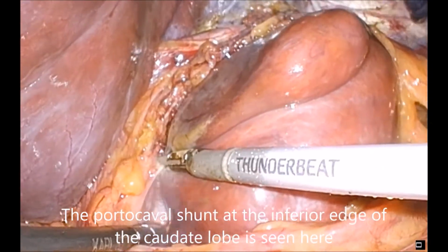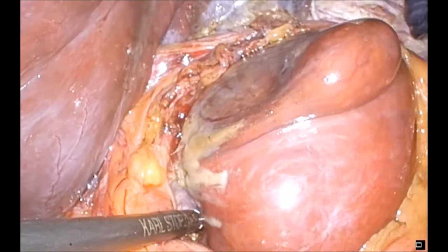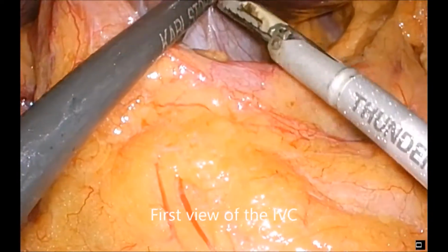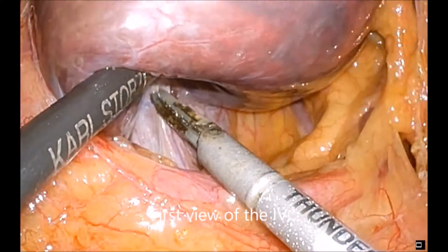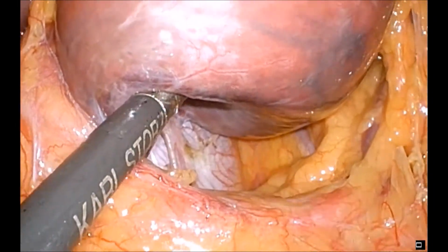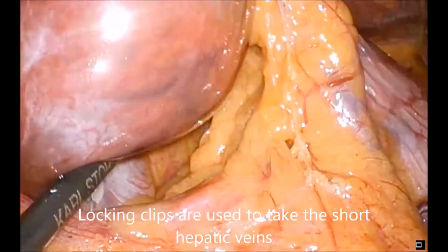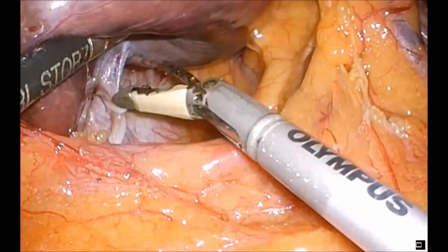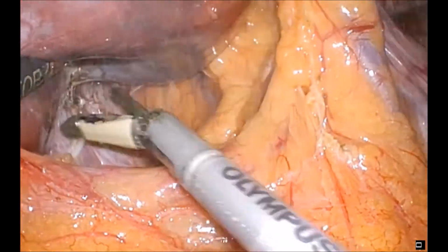We can just start to see the portocaval shunt sitting below the bulk of the caudate lobe there, with a tongue of caudate lobe tissue passing around it. And here is the vision of the inferior vena cava coming into sight now. You can see the big advantage of laparoscopic surgery in this location. This would require quite a large incision and a lot of retraction to be able to get to at open surgery, and almost always is quite bloody and has the surgeon almost standing on their head at this point, leaning over trying to see what's going on.